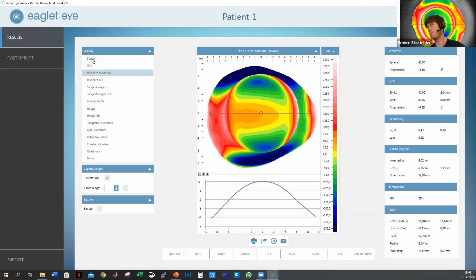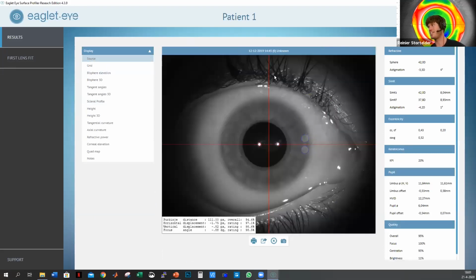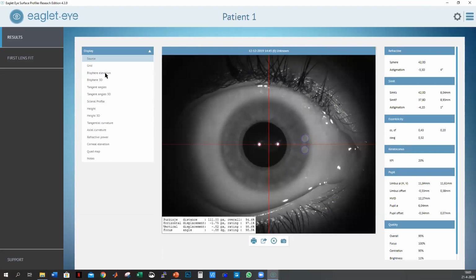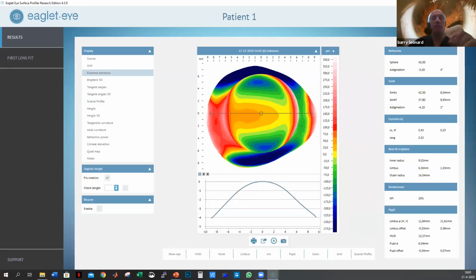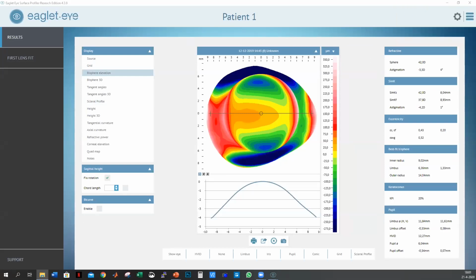What you notice here is that the eyelashes were not firmly pushed to the orbital bone, so you should have done that. We use finger cots and really get a good grip on those lashes and lids and pull them open as much as you can. So it's always a two-person job.